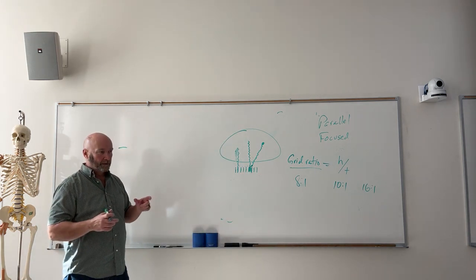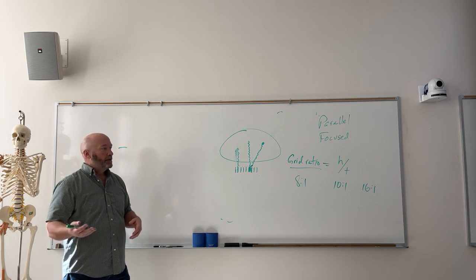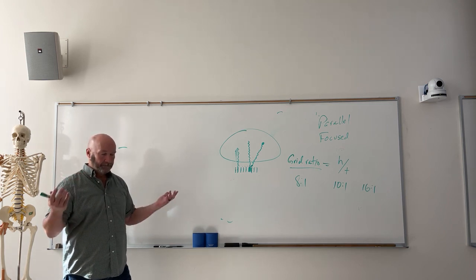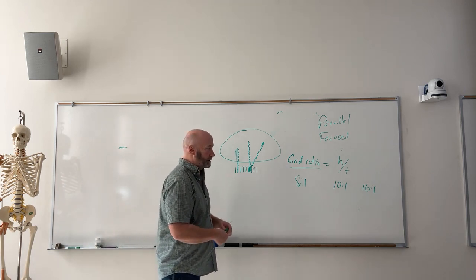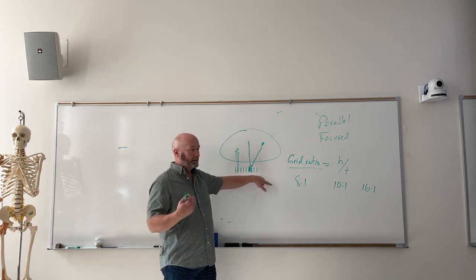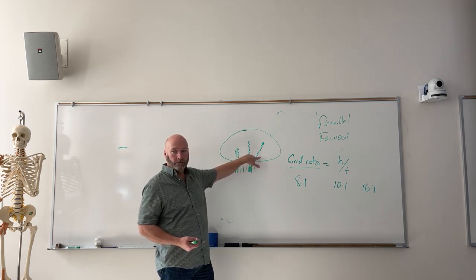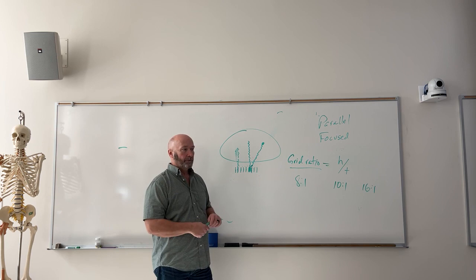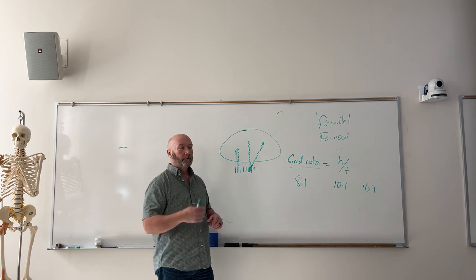All right? Now, your index number is just a compilation of X-ray photons that hit the image receptor. So let's say you made a perfect X-ray without a grid. Okay? Technically it's a perfect X-ray. Your technique was perfect, right? So your index number turned out perfect. You add a grid, and the grid absorbs nothing. Let's say in this hypothetical world, it doesn't absorb any of these, but it absorbs these. So it absorbs wide angle scatter, but allows every transmitted X-ray photon to pass through. Is that going to change your index number? If you didn't phototime, you set a technique, would that change your index number?